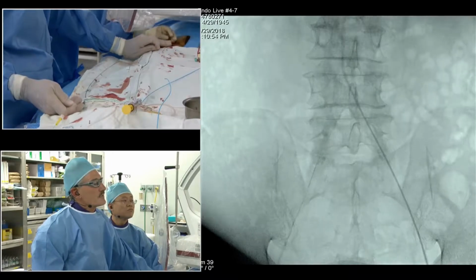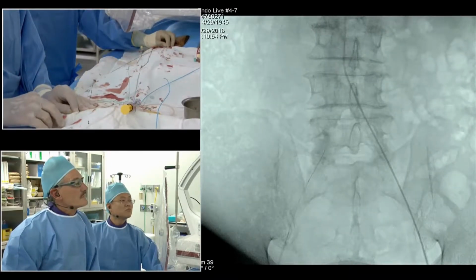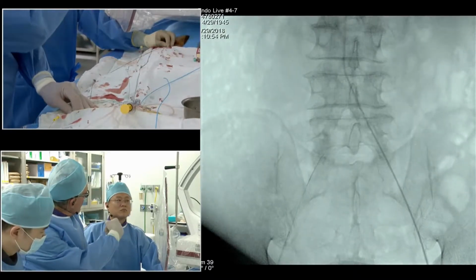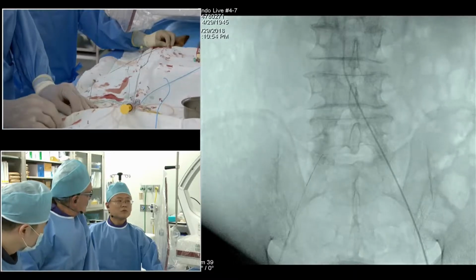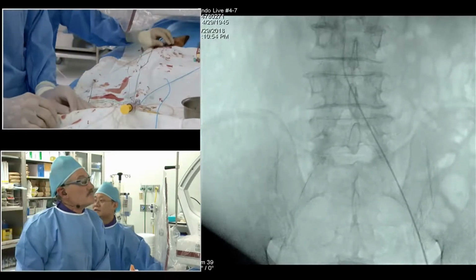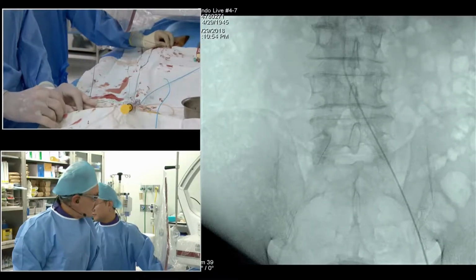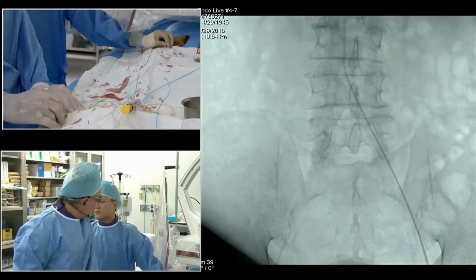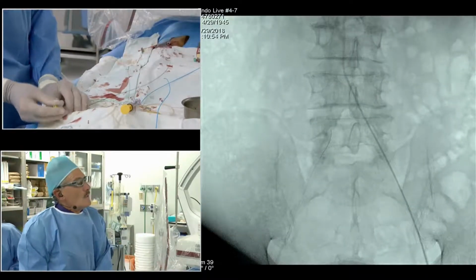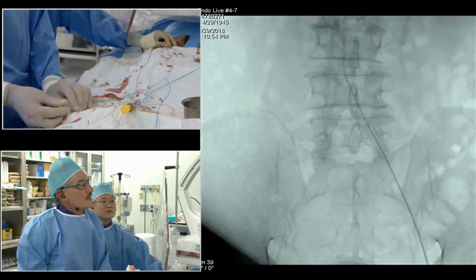Okay, while I'm waiting for a guide catheter, do you have a Memory guide catheter, or what do you have for tight up and over? Memory guide catheter? I have a 65 cm guide, a short IM, like a renal guide. Yeah, a Destino or a Tour guide would be ideal here, but we don't have that.